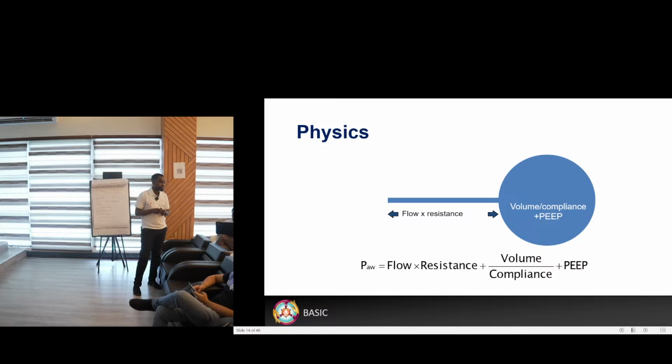Then I went back, and again the airway pressure was alarming. So this time, when I did an inspiratory hold, my plateau pressure was 20. But the alarm went off again for high peak airway pressure. So I again did an inspiratory hold, but this time my plateau pressure was 40. So I have an airway pressure of 40 and a plateau pressure of 40. This means now the problem is in the lungs.